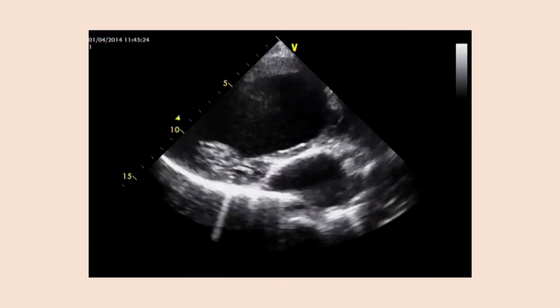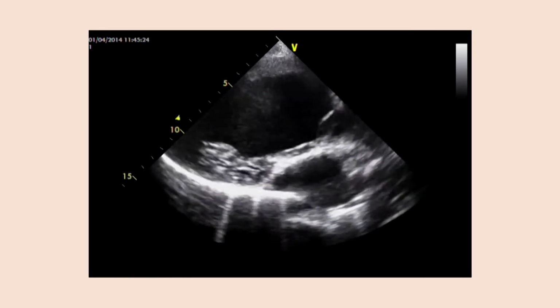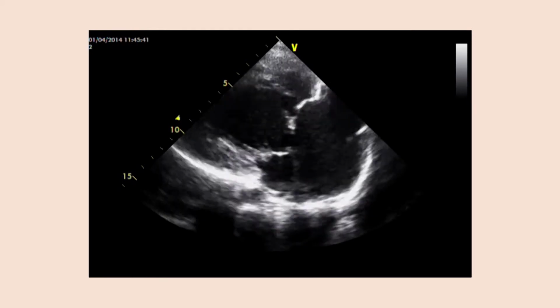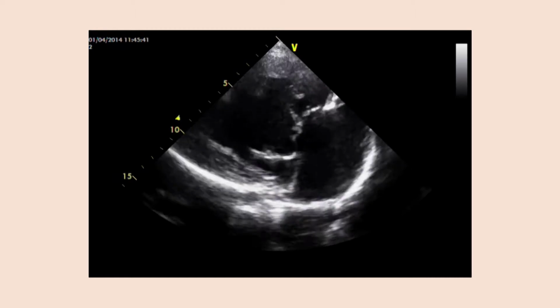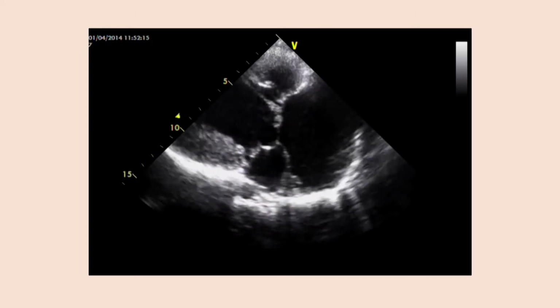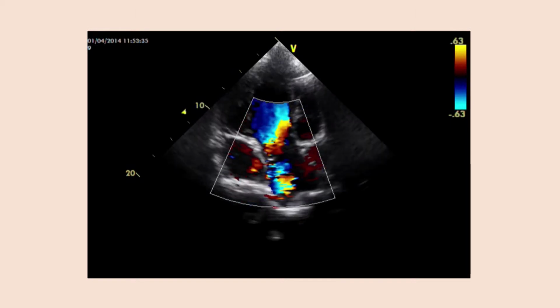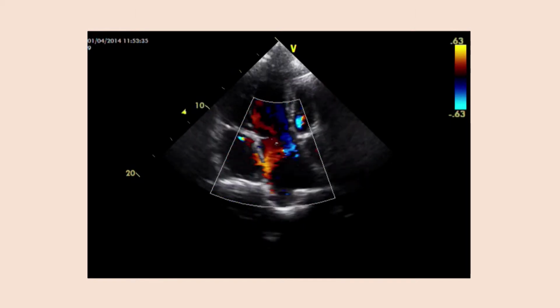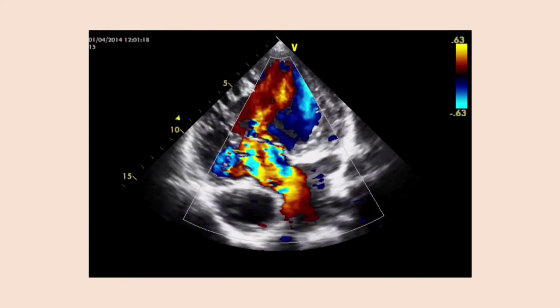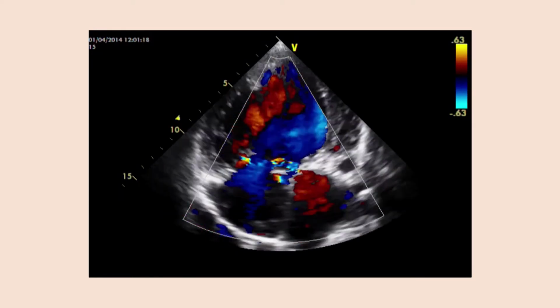Anteriorly there is a hypoplastic LV with a dilated RV, and now we can see both atria opening into the right ventricle, which is dilated, and also the RA, which is dilated. So both atria are opening into the RV, which is functional, and the LV is hypoplastic. Here we can see the flow, the pulmonary trunk, which is coming out from the RV, and the pulmonary flow. There's no turbulence there. This is the mitral, the atrioventricular flow, the mitral flow, in fact.